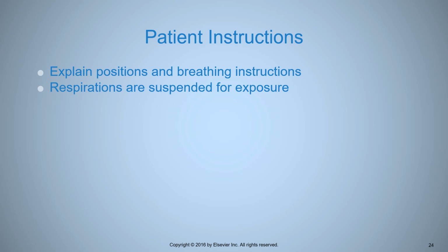Patient instructions. Your patient's got to hold still. They got to hold their breath. Breath motion is going to move the peritoneal cavity, which is also going to move the hip joint. Okay. And I do have a representative example when we get to image critique. I think we did that for this class just yesterday. Patient was breathing through a frog leg hip exposure, and we did see a motion blur artifact on that on the PACS. Okay, so holding the breath prevents that diaphragmatic motion from carrying through the lower peritoneal cavity.